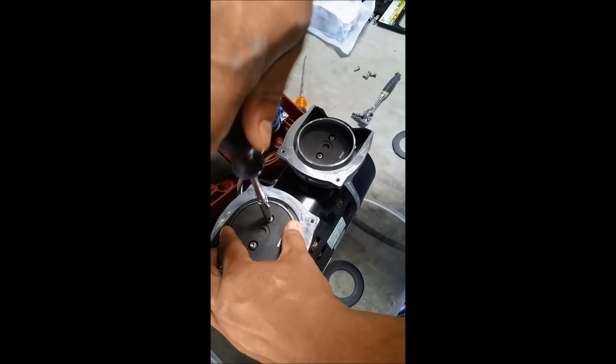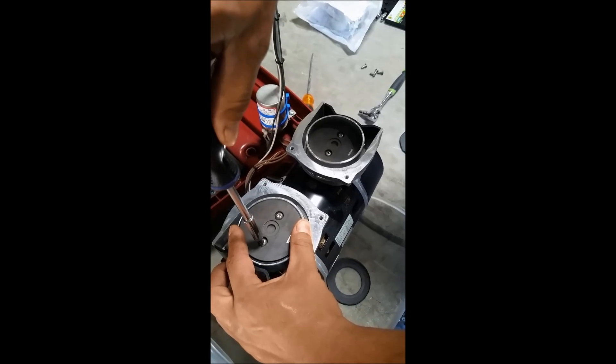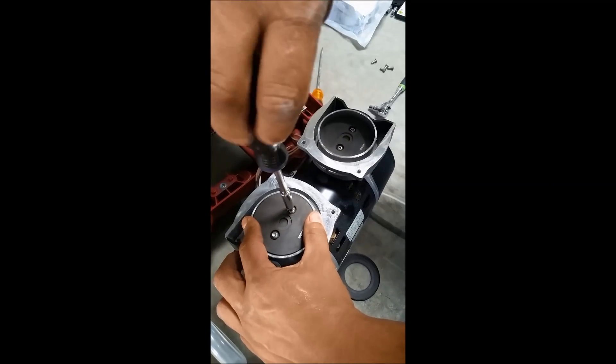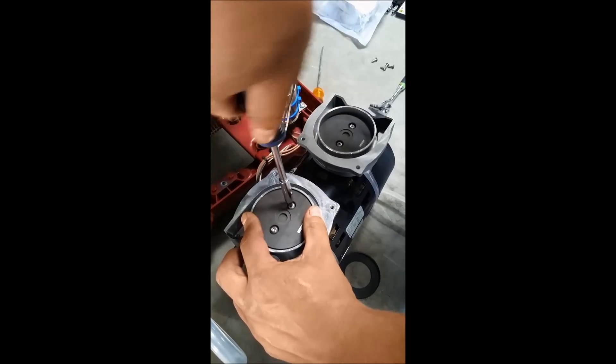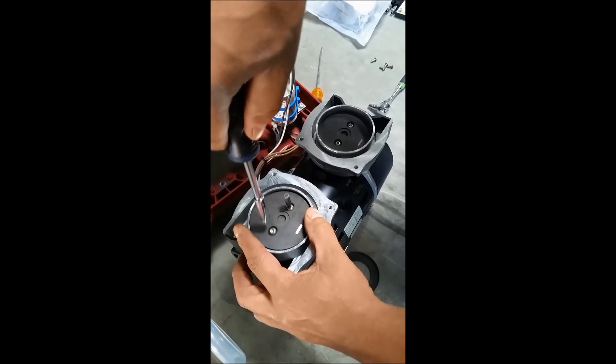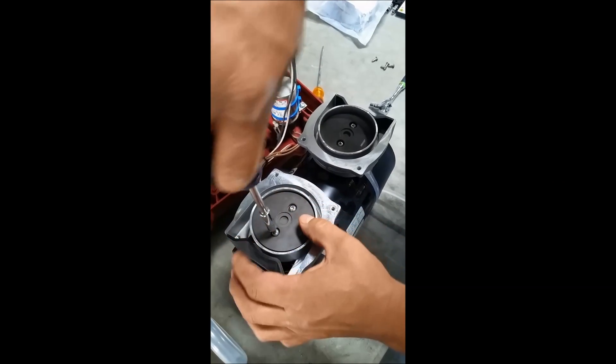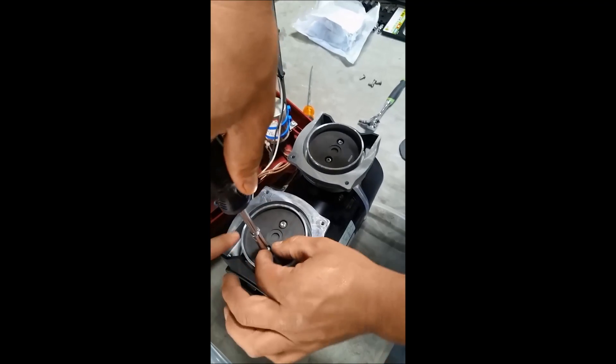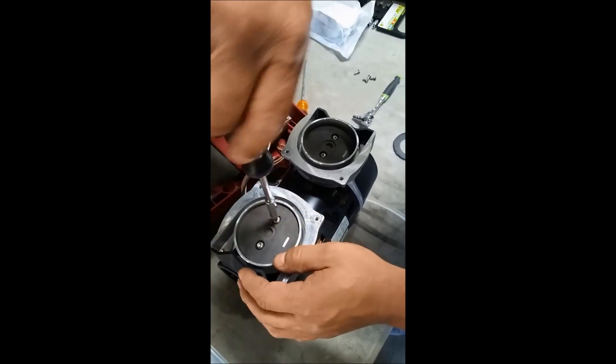We have our one side done — you can see how far it is. We're now working on the other side. It is critical that the sides are balanced and you don't have extra seal over here or over here.